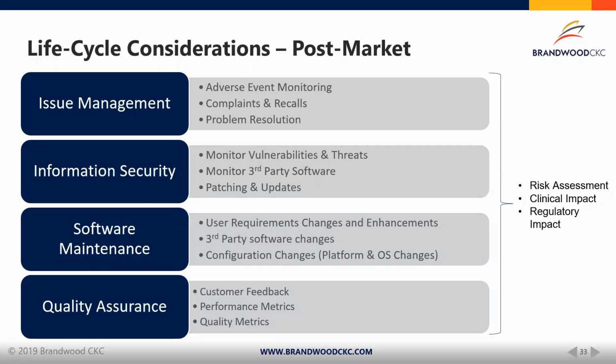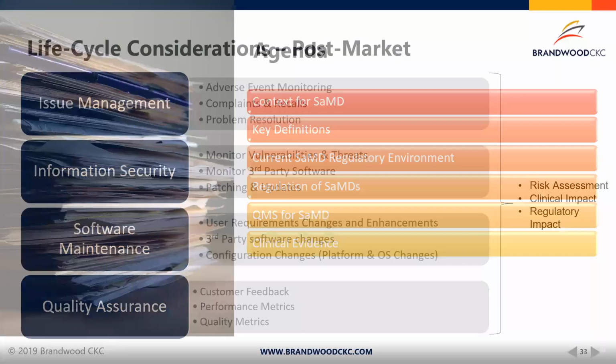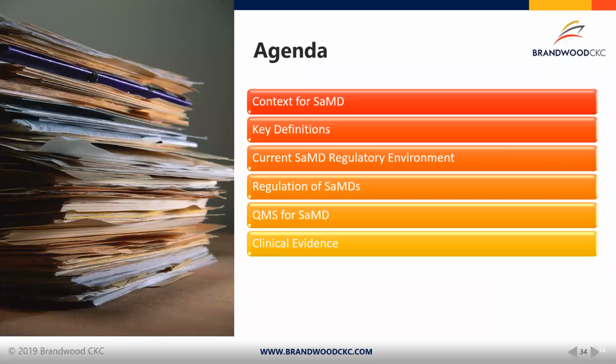During each of these processes, the risks and the clinical regulatory impact should be assessed for any impact on the regulatory status of the software to ensure that any issues, changes, and use of the software will continue to operate as intended and no new hazards arise that may directly or indirectly harm the patient. Now I hand it back over to Jean, who will discuss the clinical evaluations.